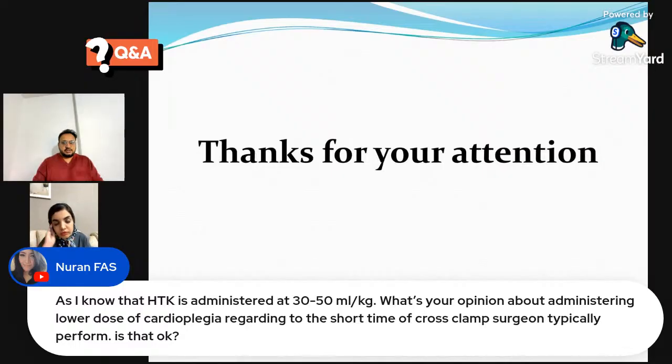We have one more question. As I know, HTK is administered at 30 to 50 ml per kg.